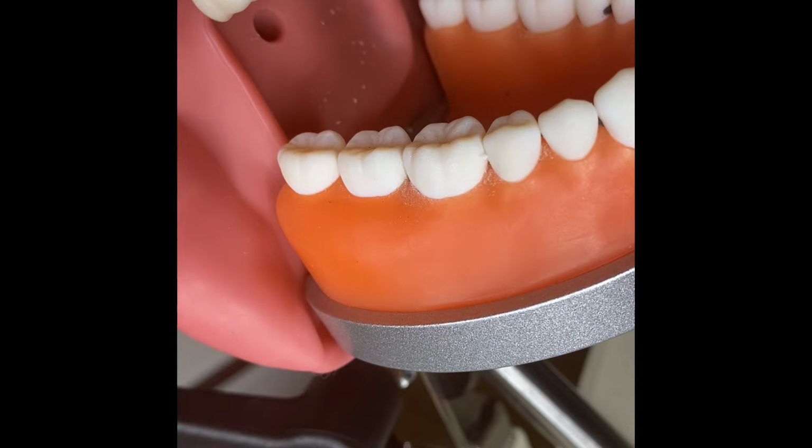In this video, I'm going to use the posterior sickle scaler to scale numbers 2, 3, and 29 and 30. I'm going to use the posterior sickle scaler with modified pen grasp. I'm sitting at the 8 or 9 o'clock position.